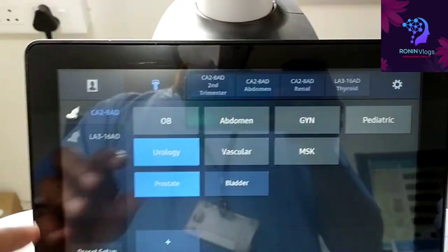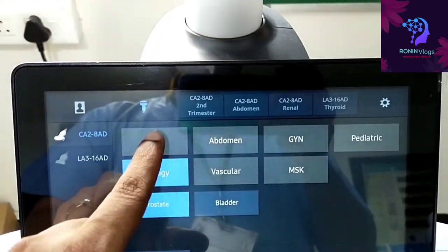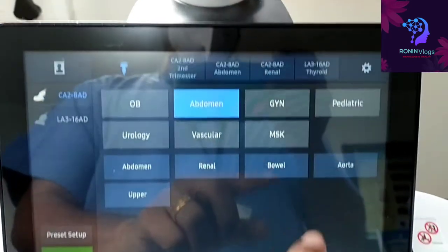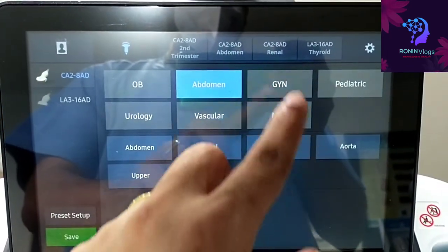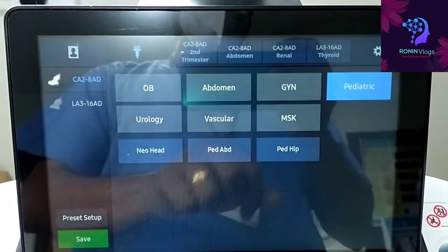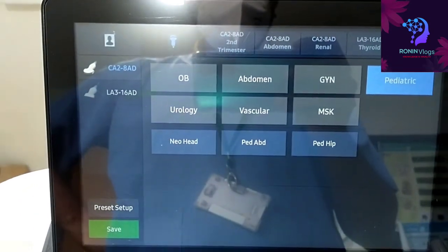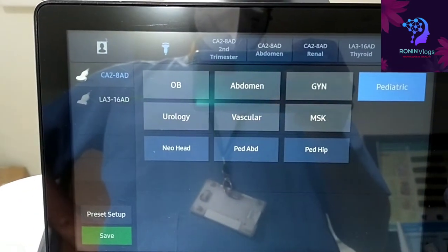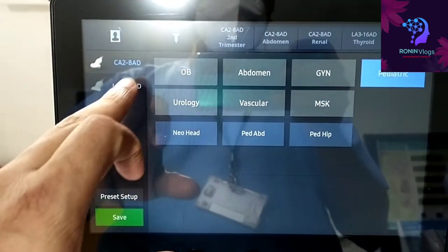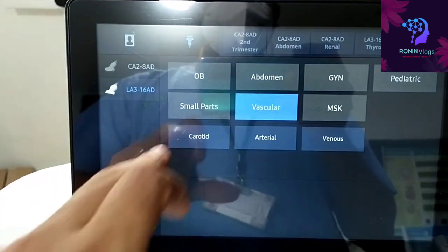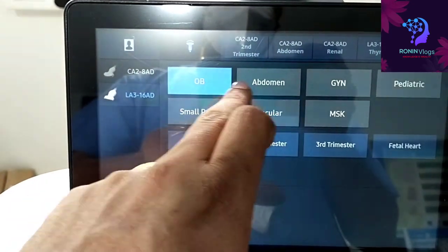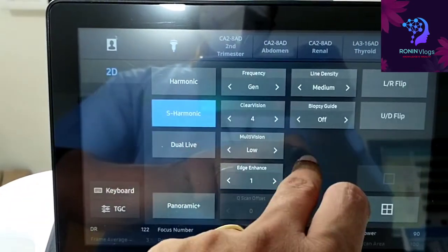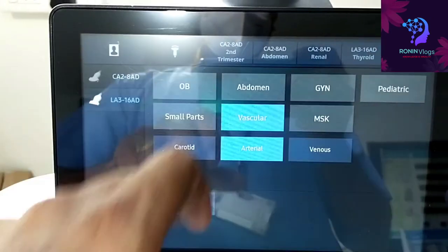gynec, pediatric, ISO option. First we need to select the probe, then which position we will select. Here we only connected two probes, that's why only two probes are detected. If we attach four probes, four probes will show there.